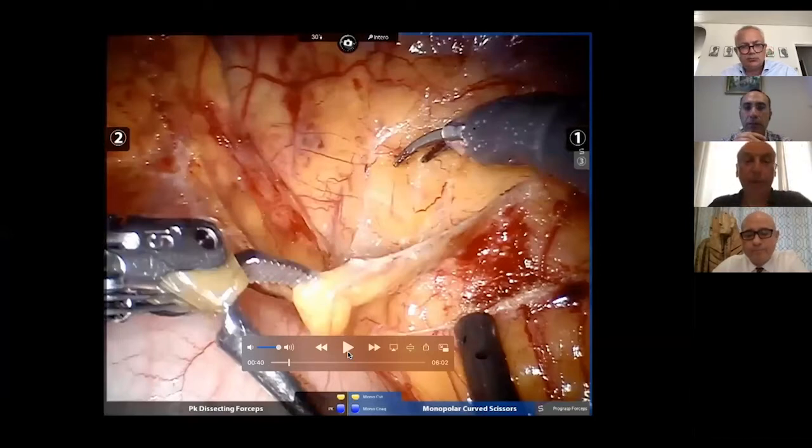Yes, it's a very interesting question, because usually we work with a company from Turin. This company, Medix, utilizes different software to create this 3D reconstruction. But the particularity of this reconstruction is that it is not made only by computers. It is made also with human intervention, because thanks to the collaboration between bioengineers and urologists, we can refine the 3D reconstruction to create the best images, useful for doing the operations. This is the advantage in comparison with the standard technique usually performed by other authors, in which only the 3D reconstruction made with the software is utilized.